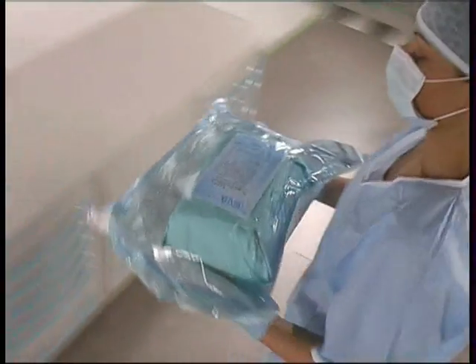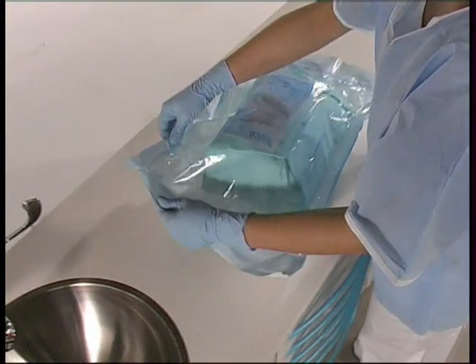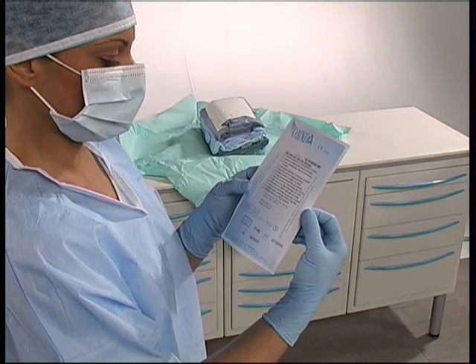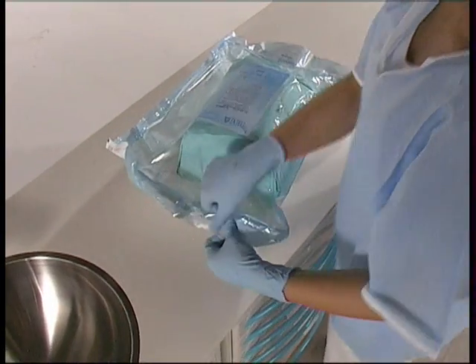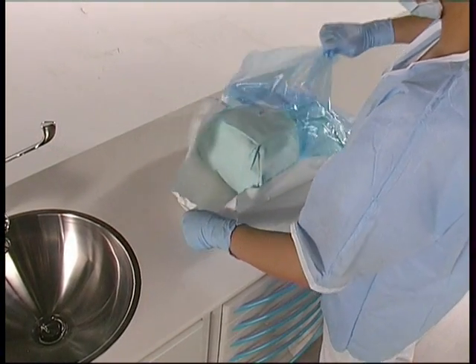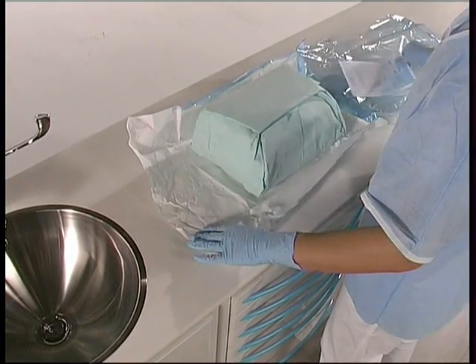Wearing a fresh pair of gloves, the non-sterile assistant checks the kit packaging for damage. She checks the expiry date and any other warnings on the package. This information must be noted on the operation record sheet. The assistant checks that the kit contains all the necessary equipment and materials to carry out the operation. Any missing items must be added at this point.